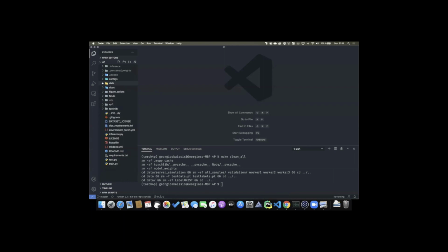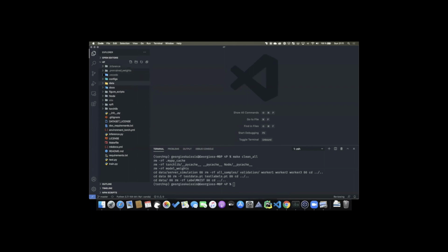So this is how the repo looks once you clone it. There's a few folders which are just local and you won't have, but there is a data folder here, and this data folder contains the entirety of this data set that we're shipping, and it's chest X-rays from children. It's about 5,000 images in the training set and about 600 images in the test set. So it's really a big data set you can actually use to do some useful experimentation. And it's a 3-class classification problem.